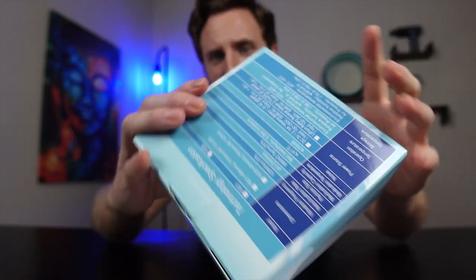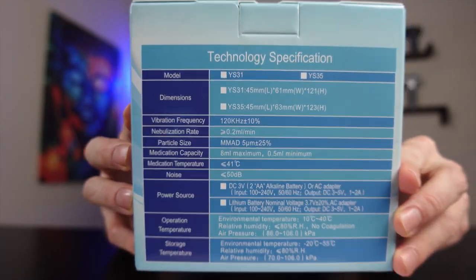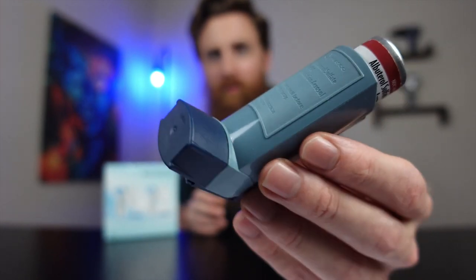Here's what the packaging itself looks like, and on the back it has all of the specifications. This is what I usually use — my little albuterol inhaler — so I'm kind of curious how this is going to hold up next to it. Let's go ahead and give it a try.